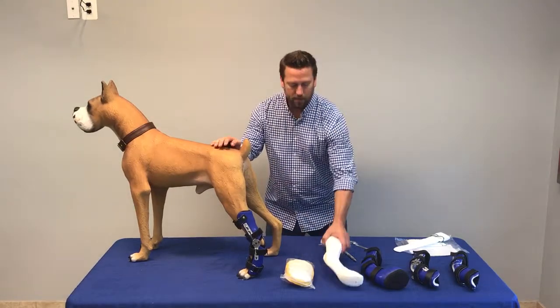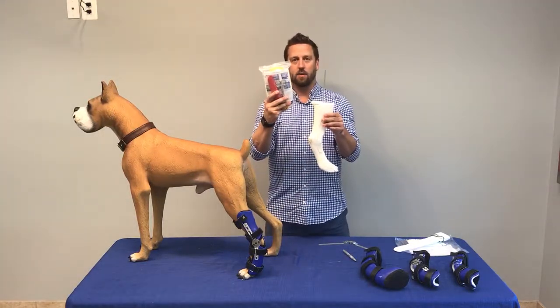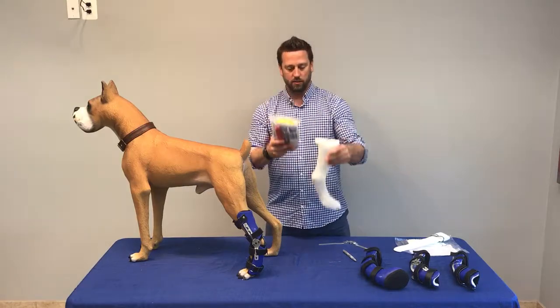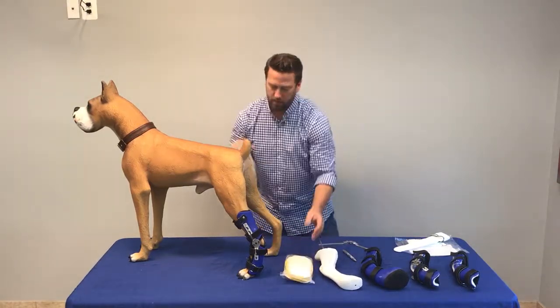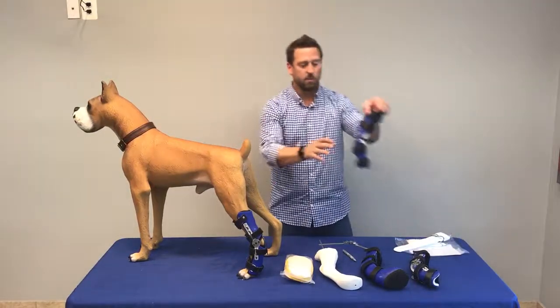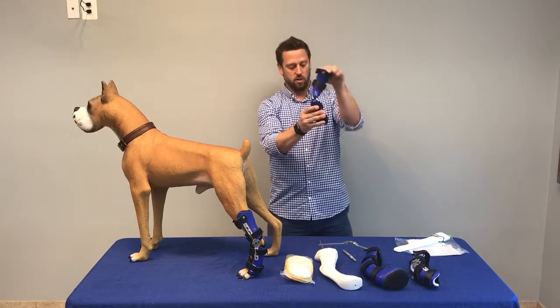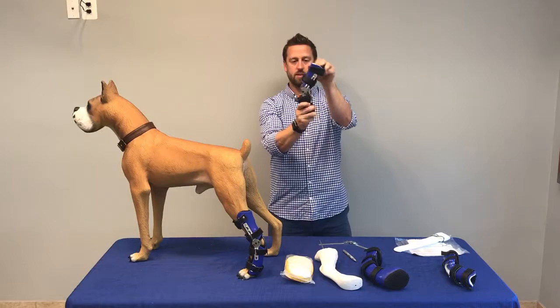These are custom-made devices made off of a cast mold. We send a casting kit out, you make a mold like so, and we would custom build it in five to seven business days. These are made in all different shapes and sizes with different joints. Sometimes we use what's called a tamarack joint, or also a range of motion joint, for adjustable flexion and extension.